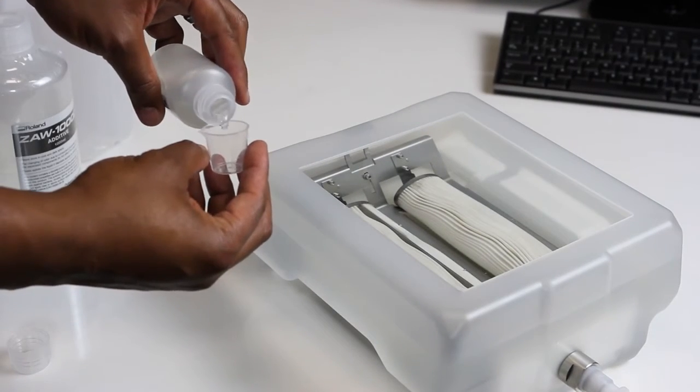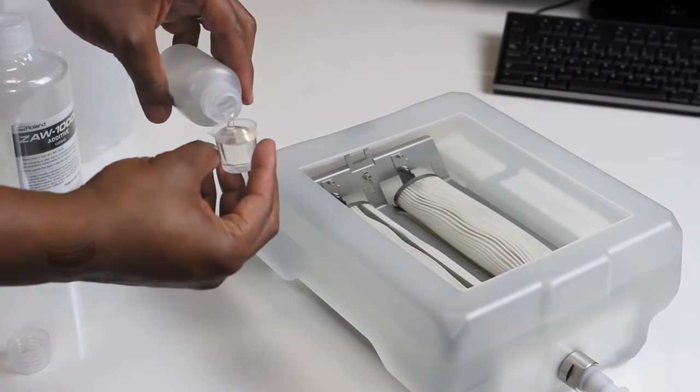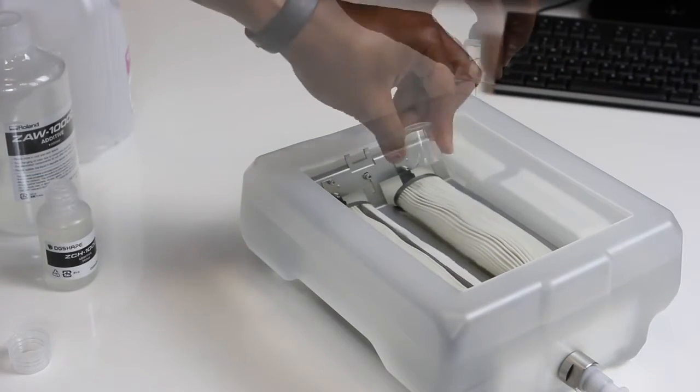Finally, using the small measuring cup, pour in 12.5 milliliters of chelate agent.